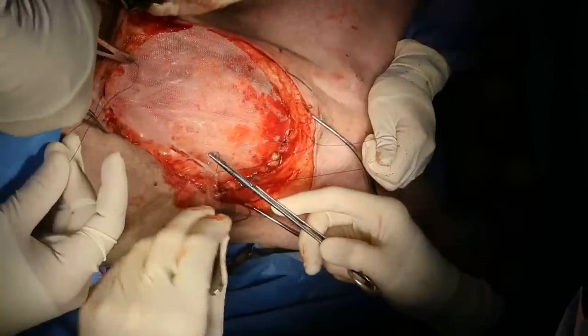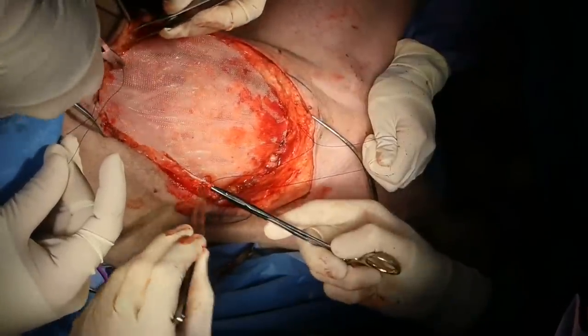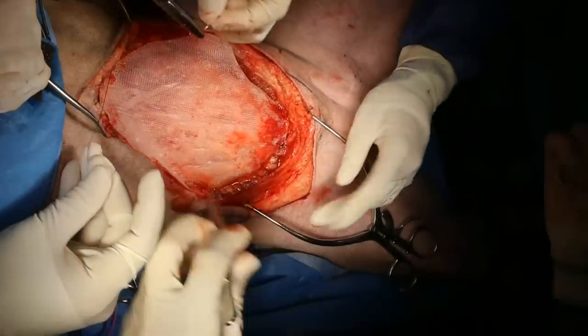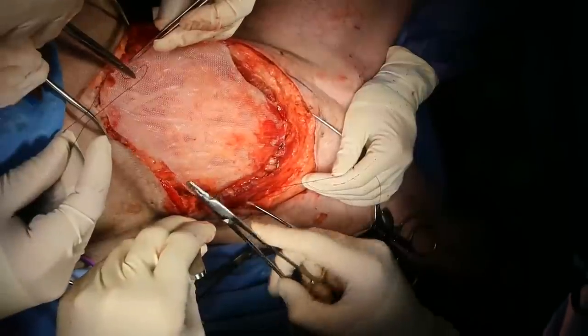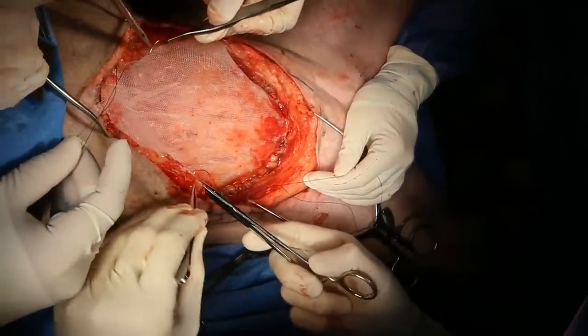There's a question, does the polypropylene mesh come sterile or do we have to process it? So I have to process it myself. The way you process it is that you soak it in 95% ethanol for about 30 minutes and then just ethylene oxide it.